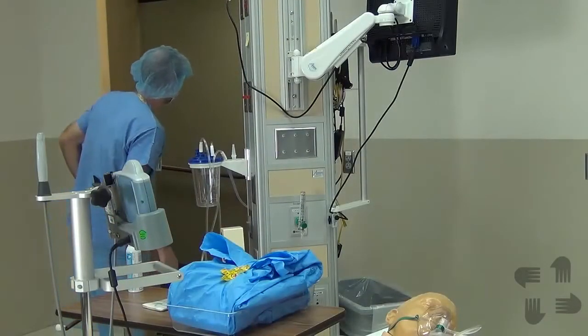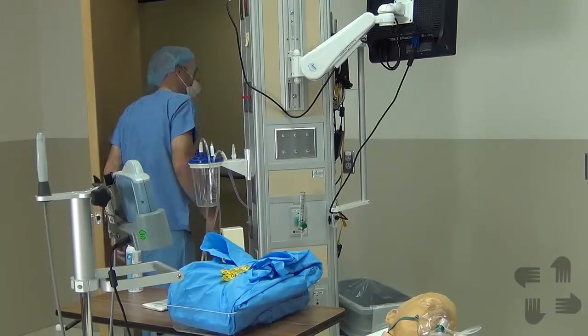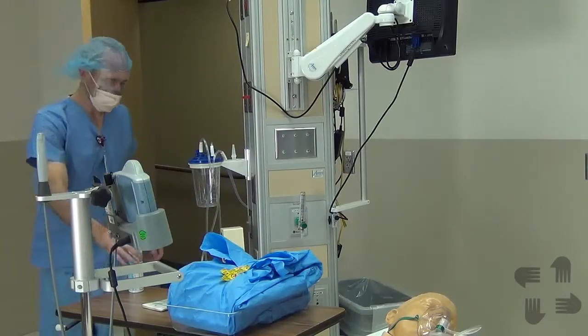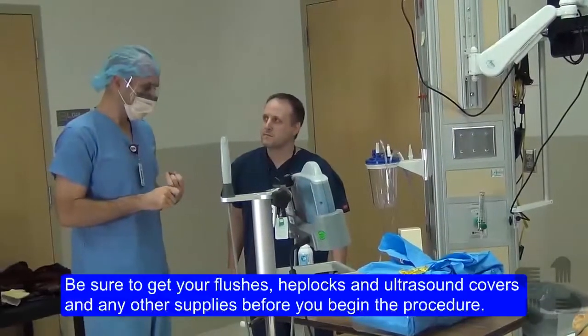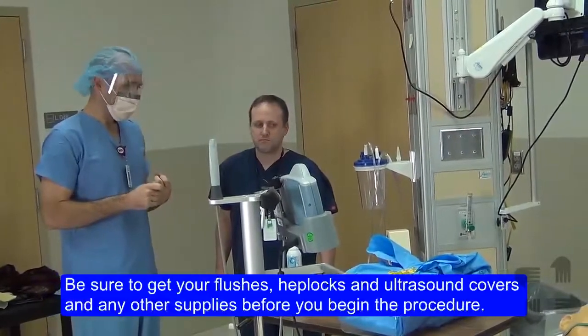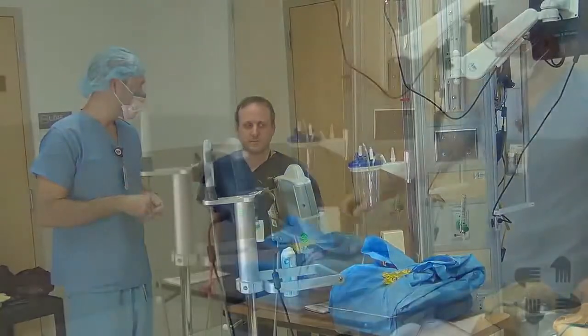Hey Trent, would you come help me with this line, please? Yep, no problem. If you wouldn't mind getting me some things, I need a sterile ultrasound probe cover, I need 3 Heplock caps, and a handful of flushes.